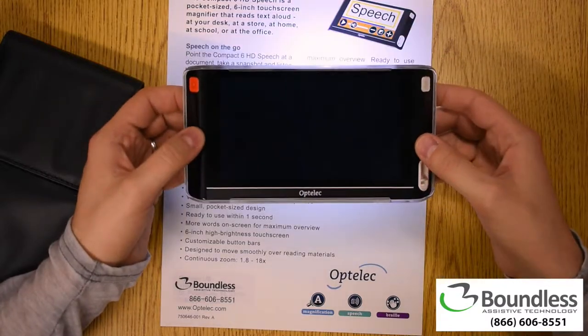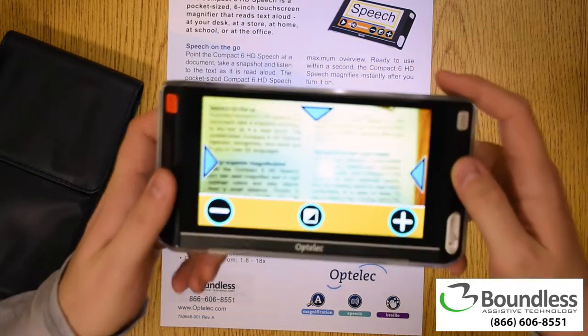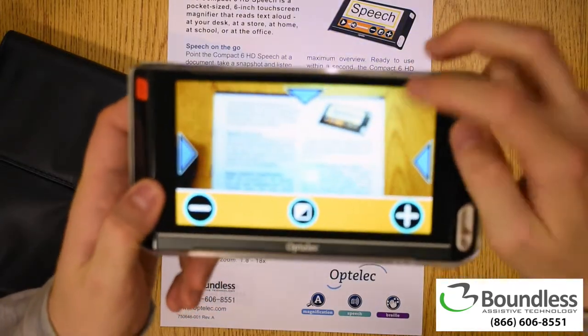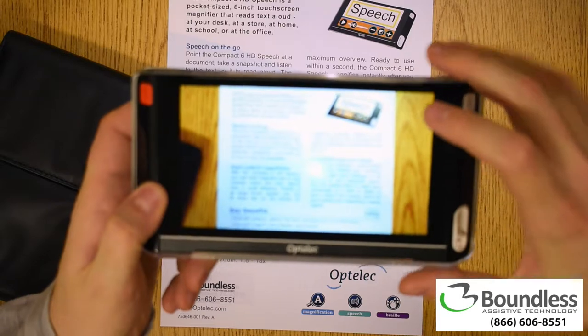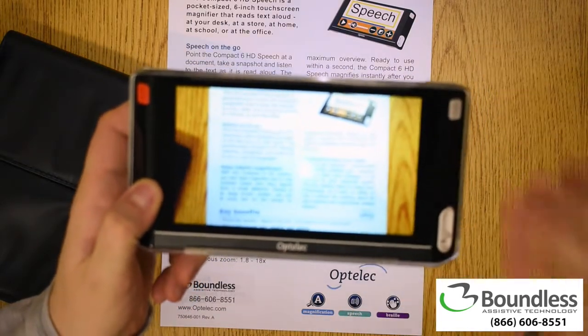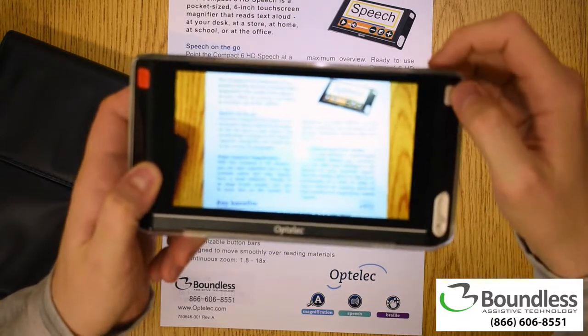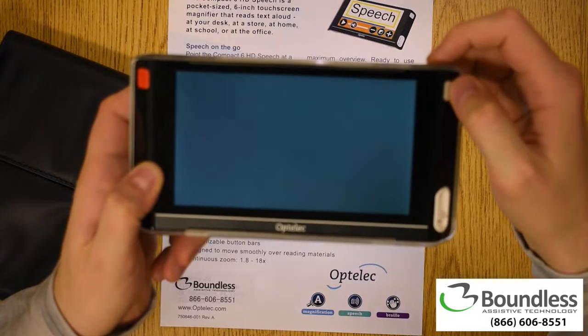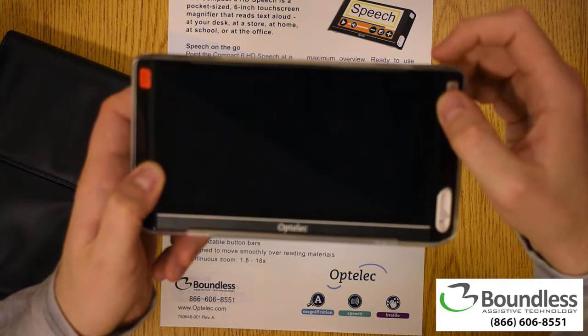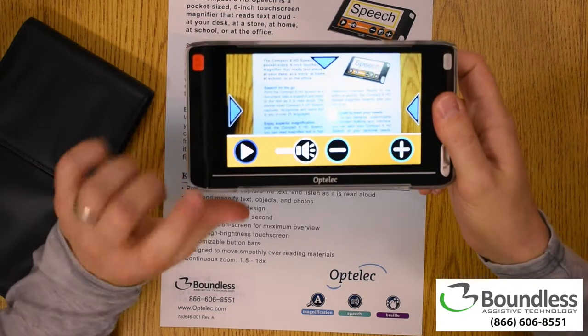I'm going to go ahead and wake it up from sleep — it's telling me I'm in overview mode. So I'll get a nice overview here of the document. Maybe I can't read this right now due to my visual condition, but that's okay. All I need to do is see the borders and then say alright, this is going to start reading for me. I'll click the button, and it's going to take a really nice crisp picture. It's already taken it.